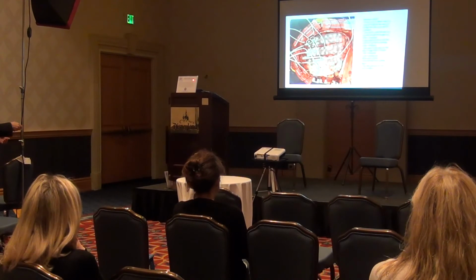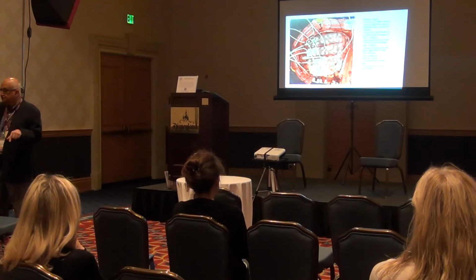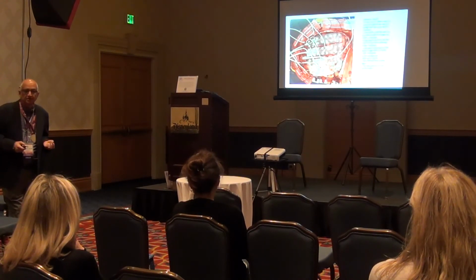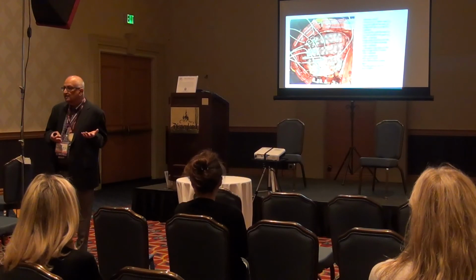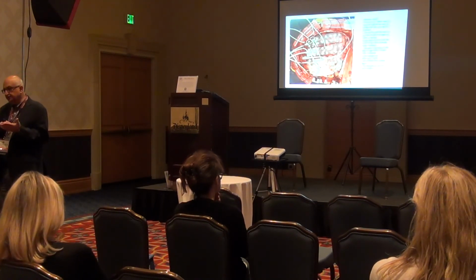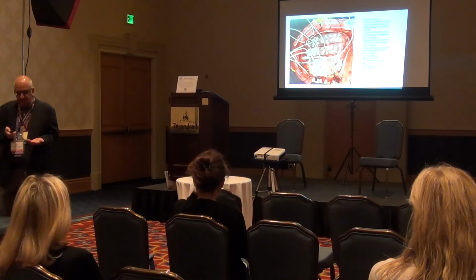But the point is you can see how many electrodes there are. And they are going right on the brain surface or into the brain, so you can record with great precision. Why? Because the seizures are coming from the motor area, they're highly refractory. We want to know the relationship of the seizure focus to functional areas, right?